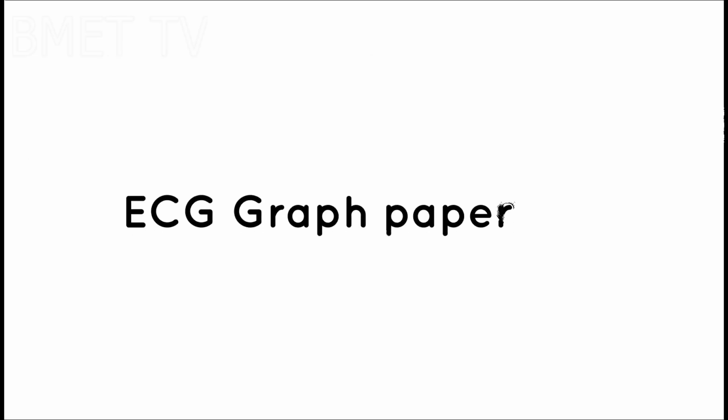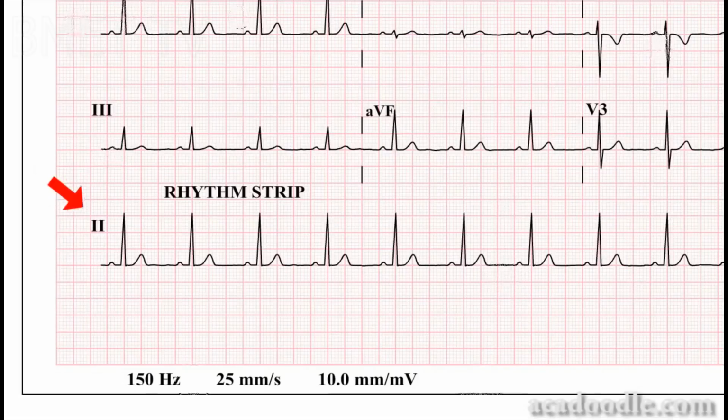Now, let's look into ECG graph paper. An ECG is a graphical display of electrical energy generated by the heart over time. ECG graph paper records cardiac electrical activity at a rate of 25 millimeters per second. The paper is divided into small 1 millimeter squares with thicker lines every 5 millimeters. It follows then that the width of an ECG tracing is a measurement of time.